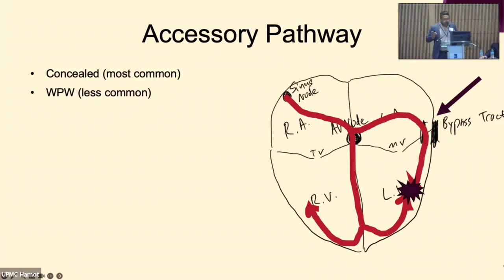Remember, anytime the left ventricle gets activated by myocyte to myocyte conduction, meaning this is not going down the His-Purkinje system, this is cellular activation, which is what ventricular tachycardia is, right? It's coming from somewhere down here, and it's myocyte to myocyte conduction. That QRS is wide because it's very inefficient conduction. It takes the heart muscle a long time to generate that QRS, and that's why you end up with a delta wave.